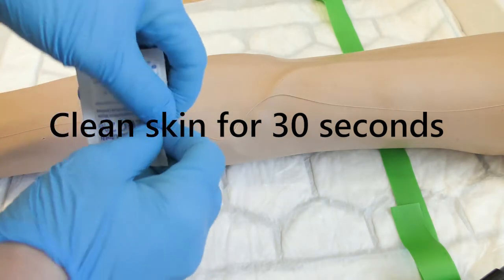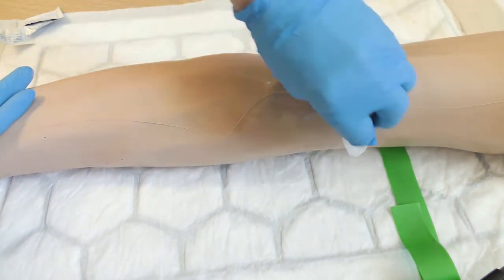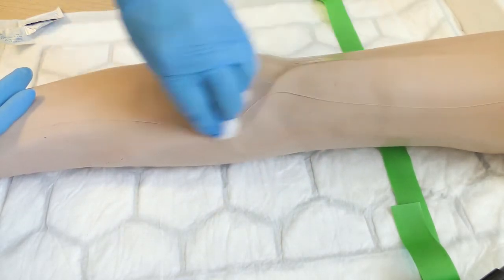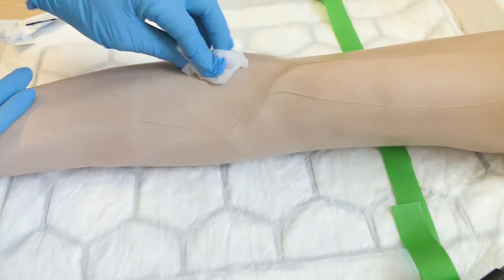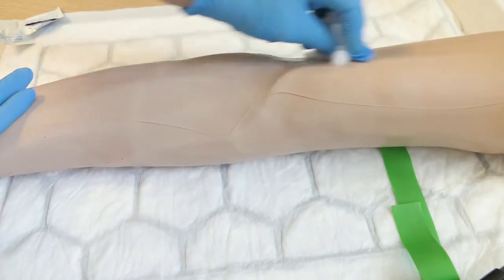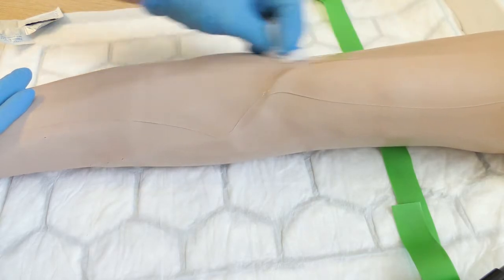Clean the patient's skin for 30 seconds. The correct method is called crosshatch — go over and over the same area of skin, up and down, backwards and forwards. Maintain constant contact with the skin. Ensure this is timed for 30 seconds.